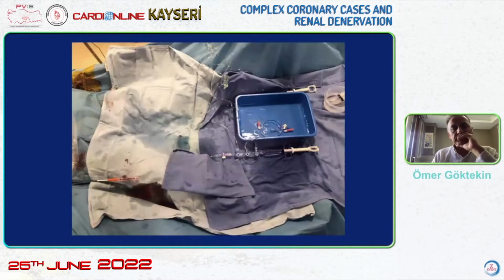I'd like to show you such a slide. In bifurcation lesions, sometimes we use short wires, and it's very difficult to sync them. So we have such a fabric that should be a thick fabric. With the use of this, we can just sync 3 wires. In the beginning, there is the main branch wire, and on both sides of this fabric, we use the side branch.